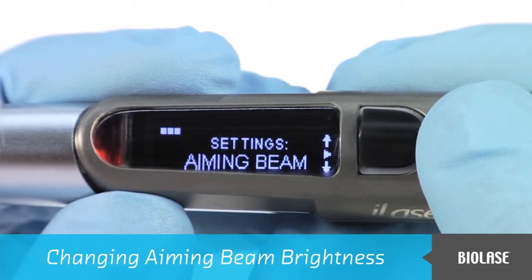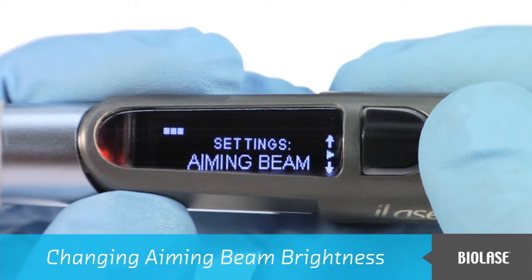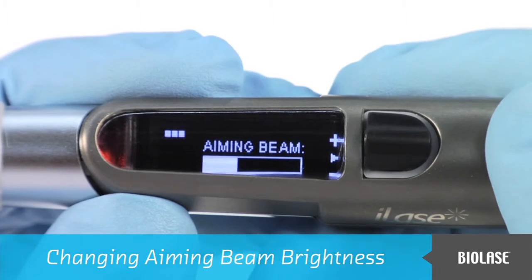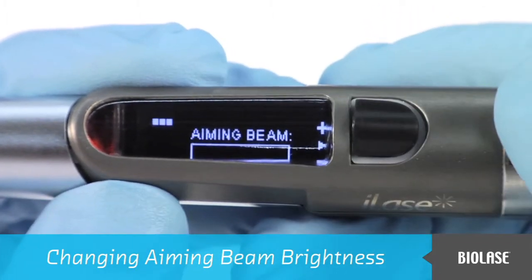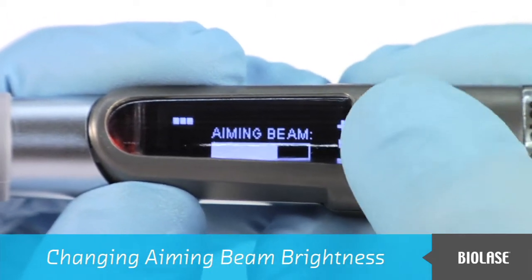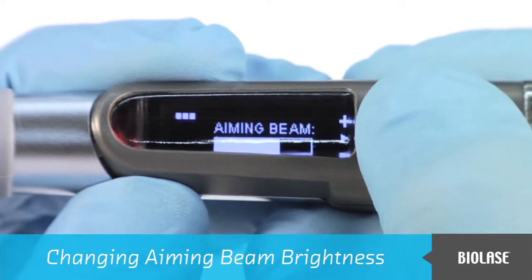To change aiming beam brightness, first enter the Settings menu, then scroll to the Aiming Beam option and press in the navigation button. Pushing the navigation button down will dim the aiming beam, and pushing the navigation button up will brighten the aiming beam. To select the appropriate brightness level, press in the navigation button.